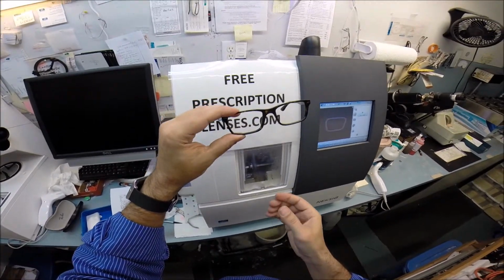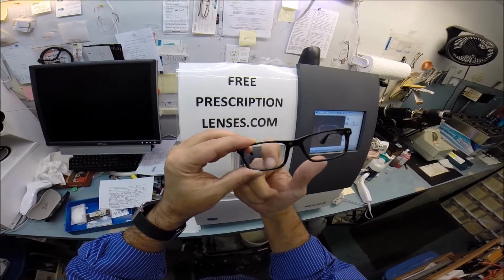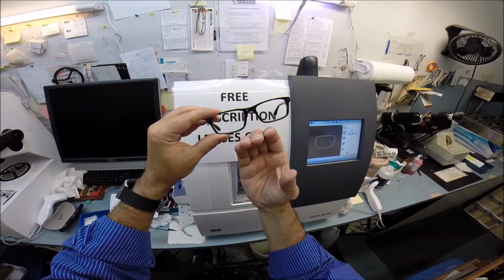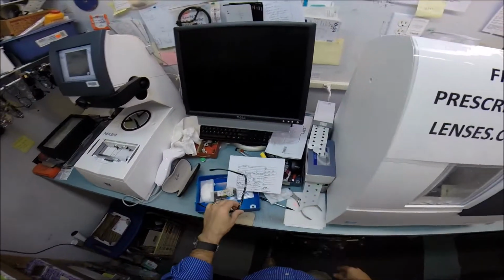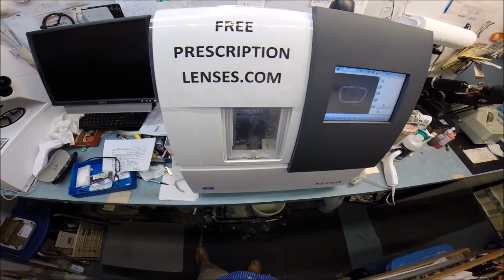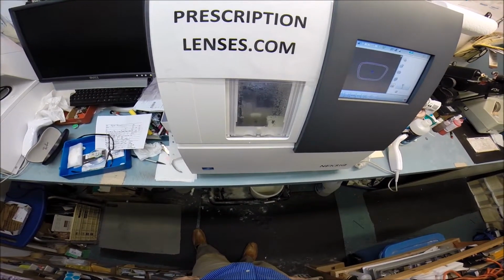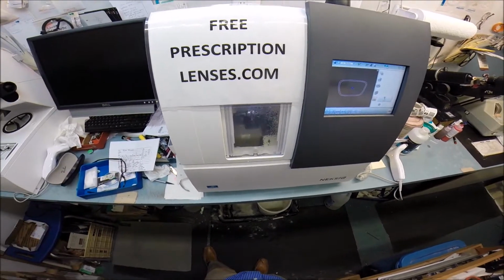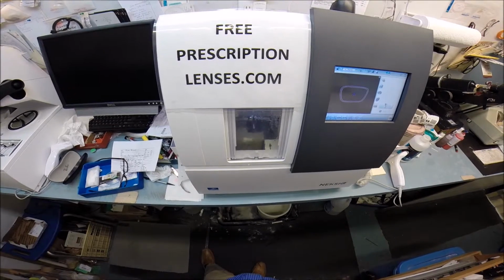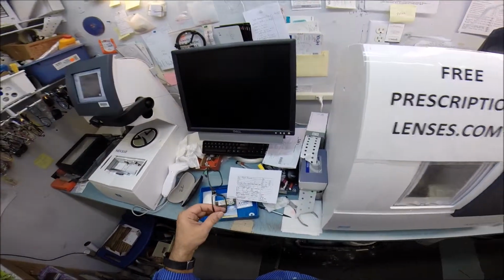When I say "we" in the business, if you imagine your frame, this little bevel that I can put my fingernail in, as a gutter, if your lens was too large, it would force your frame to roll outward. Gives you an ugly cosmetic appearance, shortens the life of your frame. And I'm a perfectionist. I'm not going to ship anything that is not perfect. Plus, I want you to be able to pop these lenses out in the future. Should you ever need new lenses for your frame, I can ship them right to your home. You will not need to ship me the frame again.